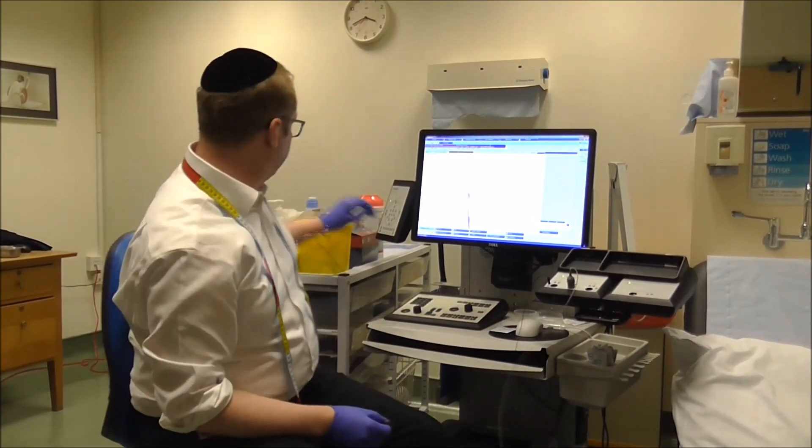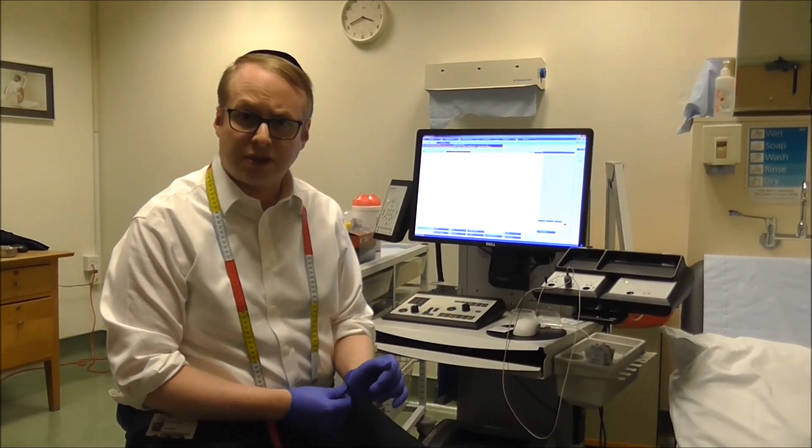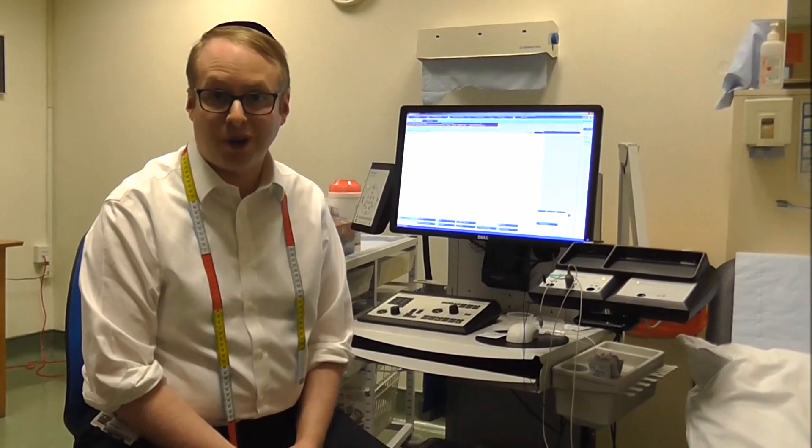When we've finished we just remove the needle, and that's the end of the study. I hope this video has helped explain what these tests are about, and we look forward to welcoming you to our department.